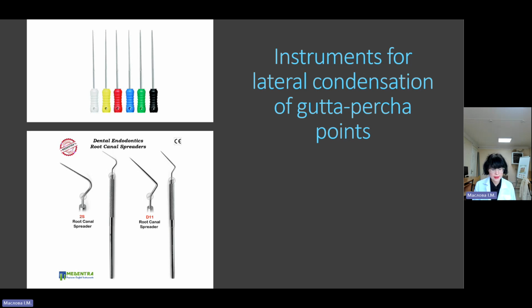The smear layer influences sealer adaptation, tubular penetration, and leakage. The greatest potential for leakage is the interface between the sealer and canal wall. Removal of the smear layer and irrigation protocols is discussed every time.